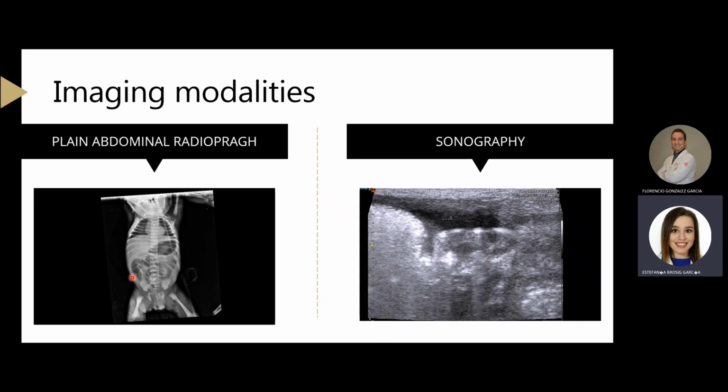The ultrasound has some advantages. It provides in real time direct images of abdominal structures, particularly the bowel, and of fluid in the peritoneal cavity.